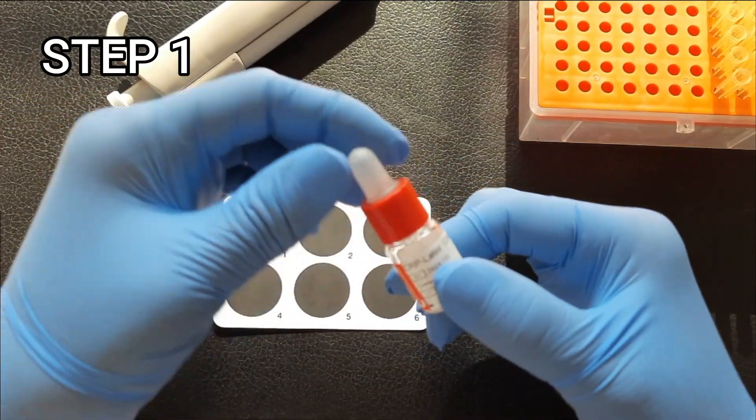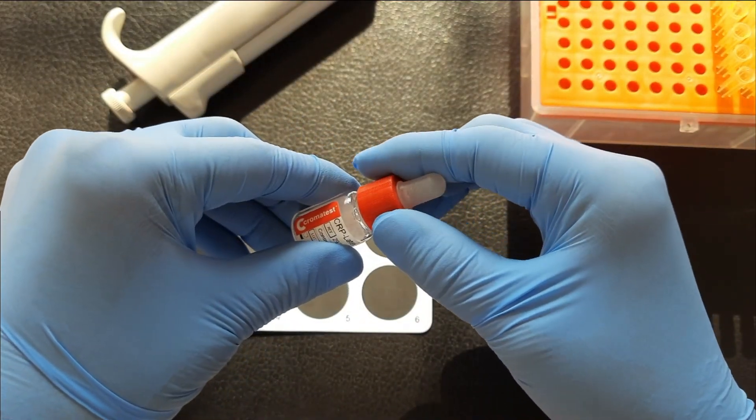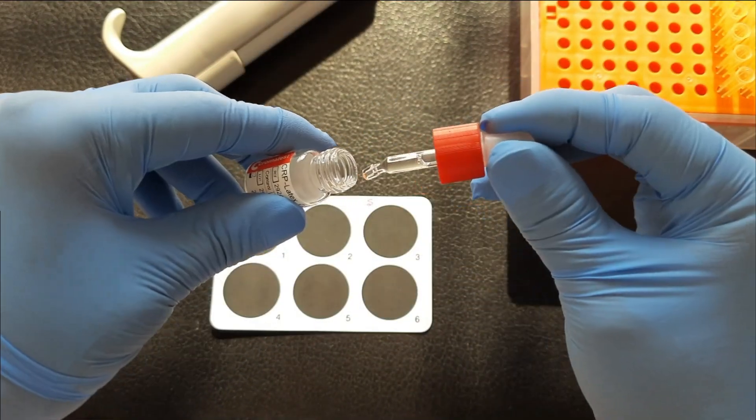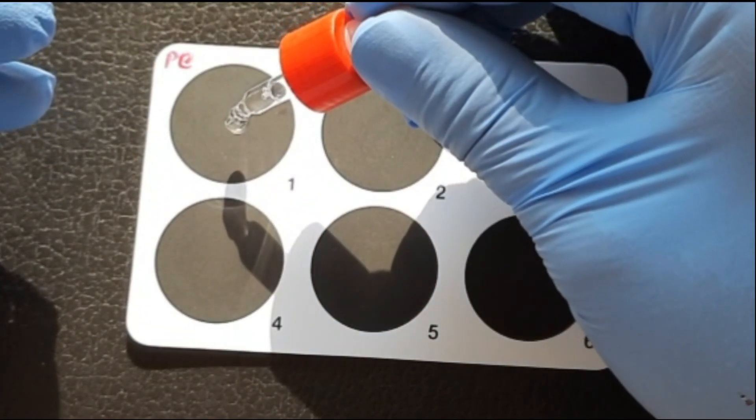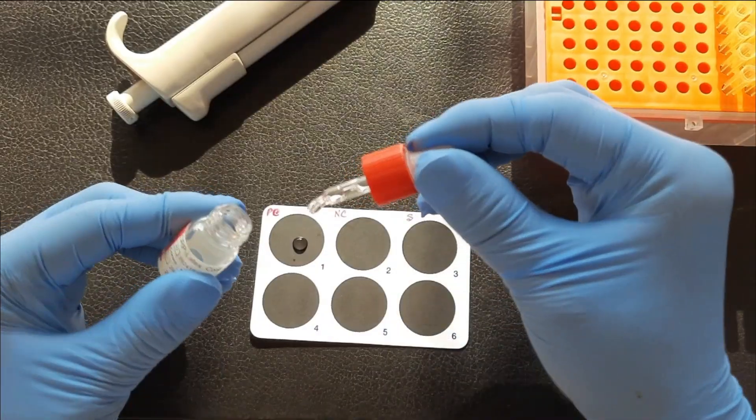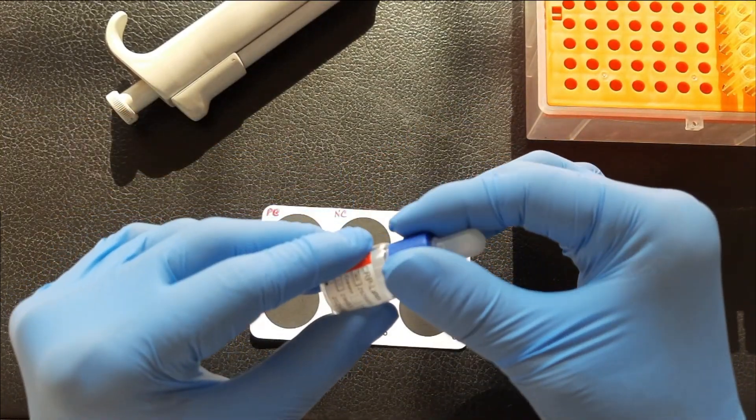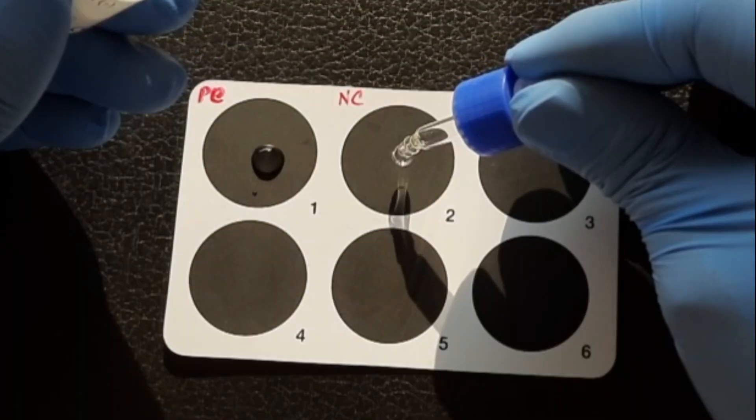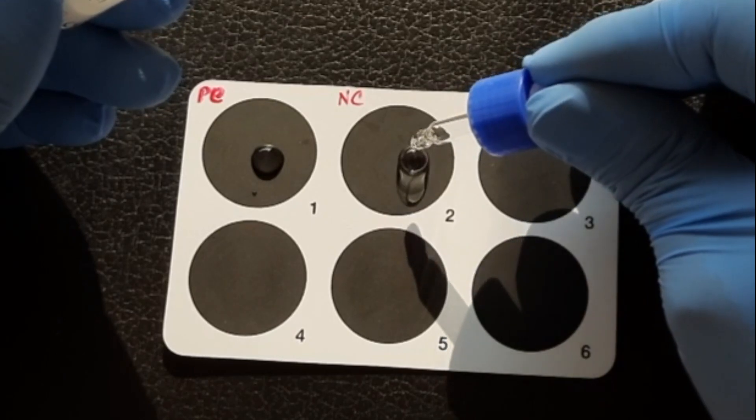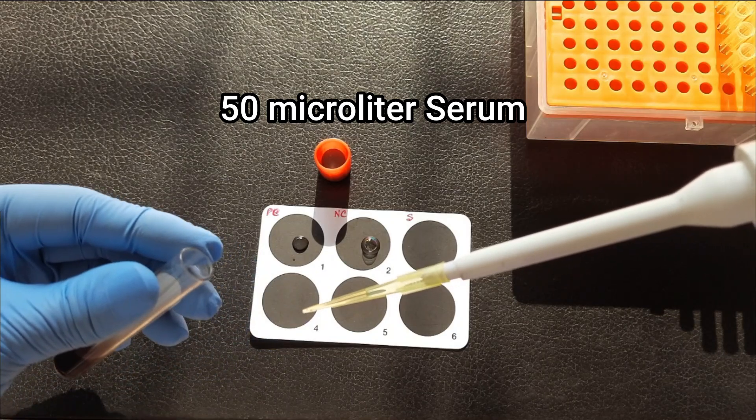Step 1. Place one drop of positive control on circle 1 of the test card, labelled as PC. One drop of negative control serum on circle 2, labelled as NC, and 50 microliters of serum on circle 3, labelled as S.